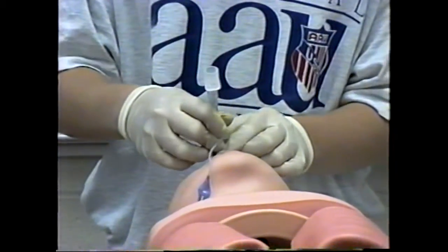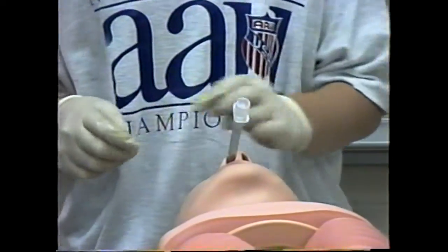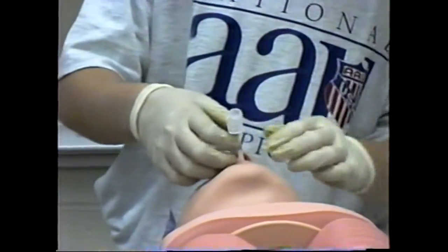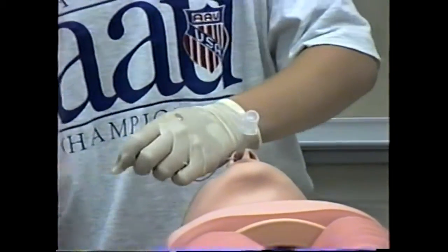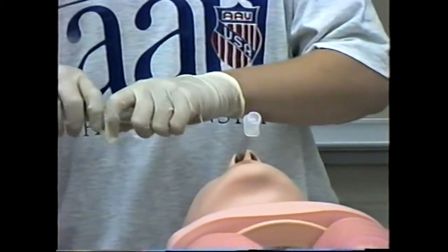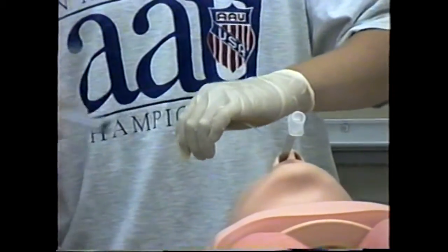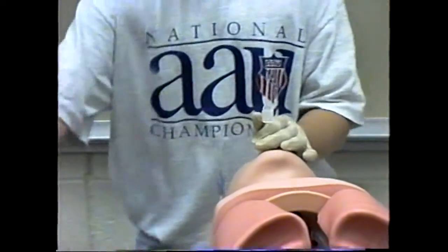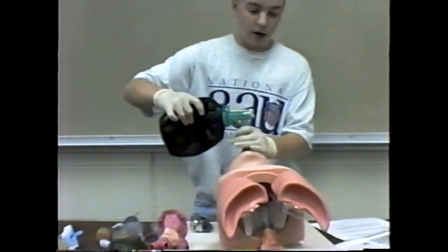And again, it goes into the endotracheal, or the trachea, until about the 26 mark. And again, you would fill the distal cuff with 6 to 8 cc's. Then ventilate them.